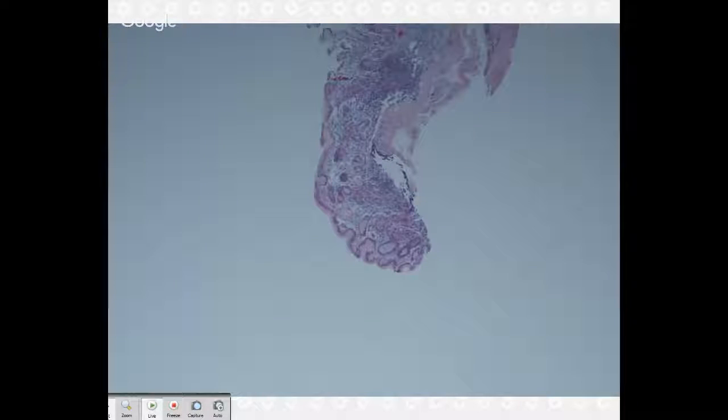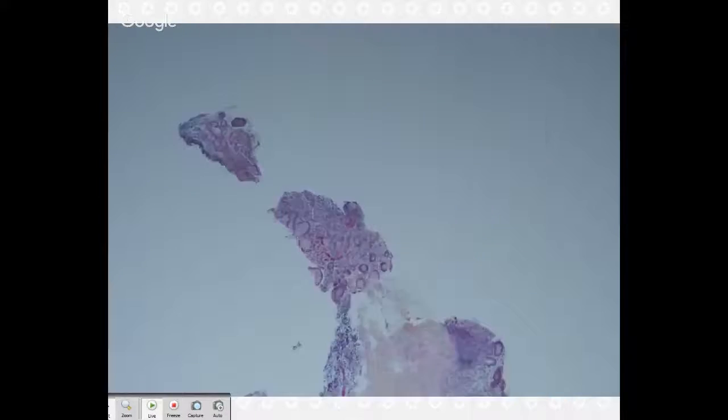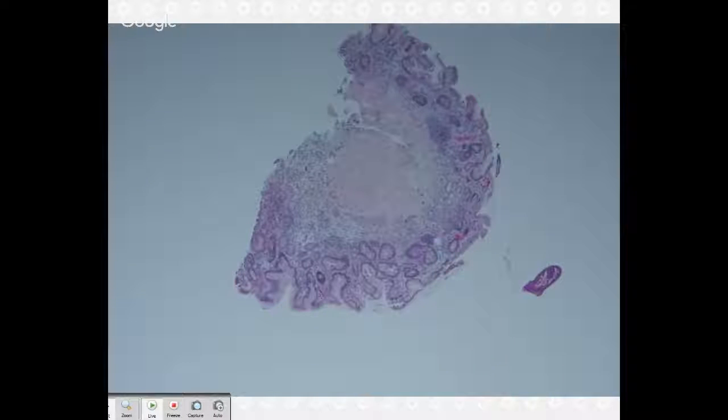So other people have called this just plain old chronic atrophic gastritis. Some people just call it plain autoimmune gastritis. So you'll hear it called different things. But the most important thing is that you recognize it, that this is just not chronic inactive gastritis, okay?